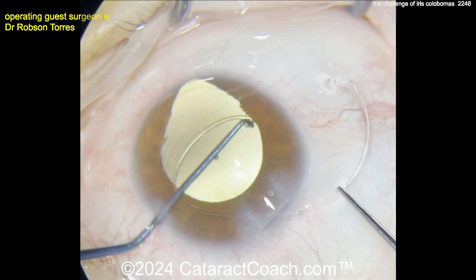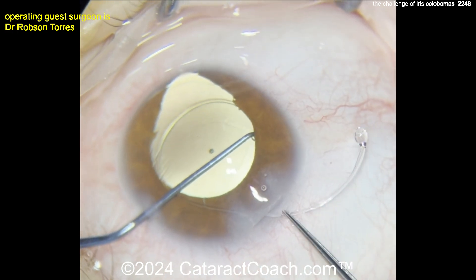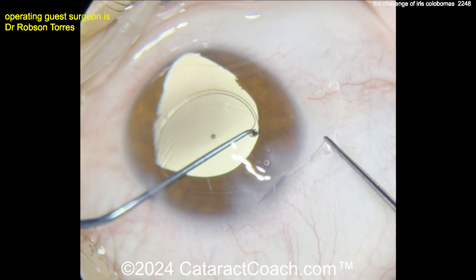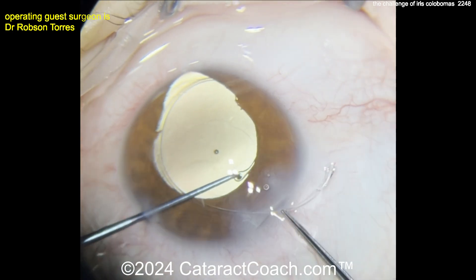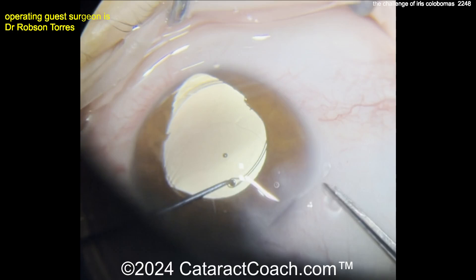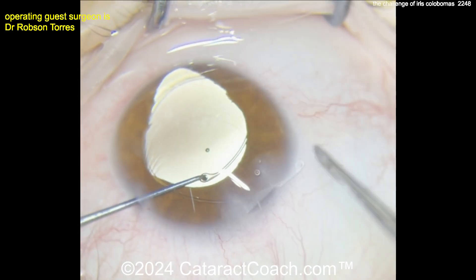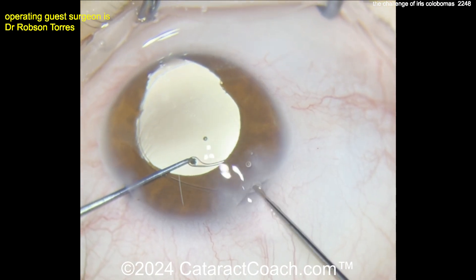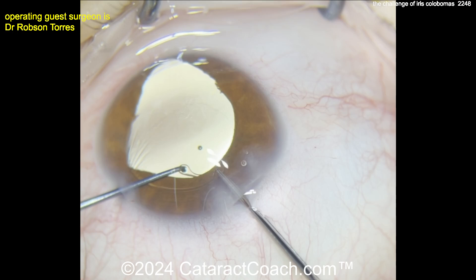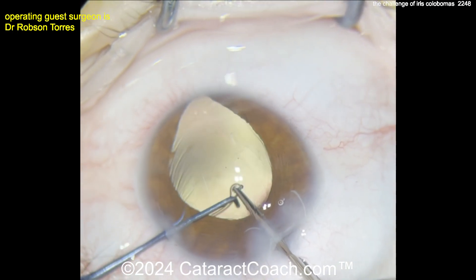In iris coloboma like this, there's typically an equal absent area of capsular and zonular support. Usually it's only about a clock hour or two — so 30 degrees, maybe 45, rarely 60 degrees. A CTR, capsule tension ring, is a great idea here because it'll bolster that weak area without requiring any more challenging procedures. You don't need to suture in a capsule tension segment or other types of scleral fixated support.